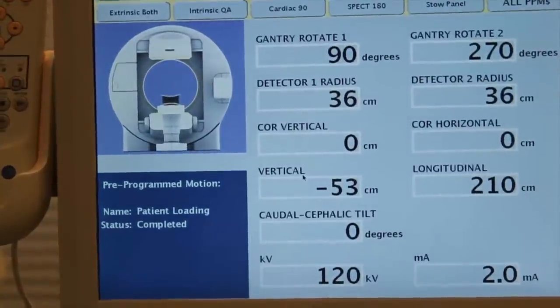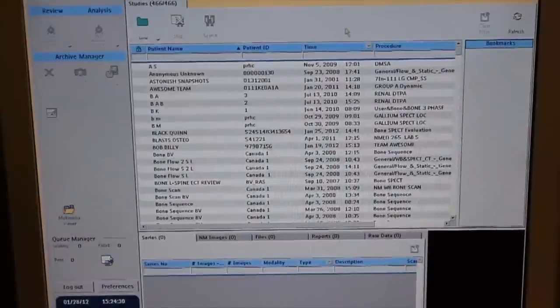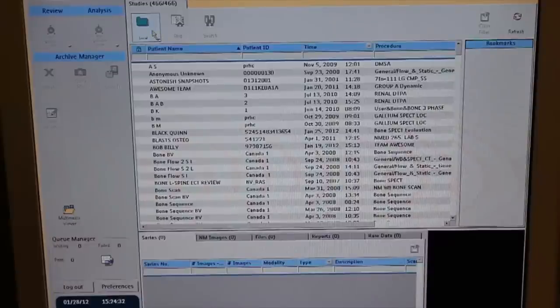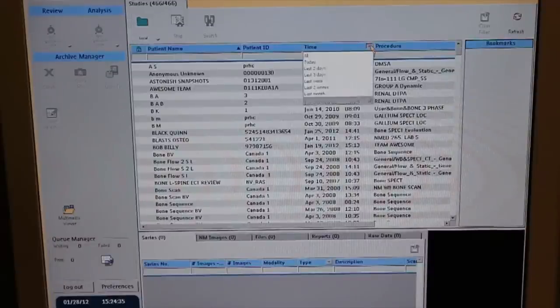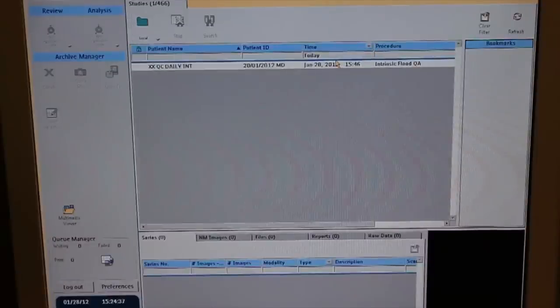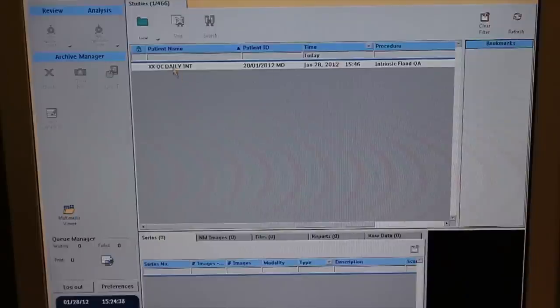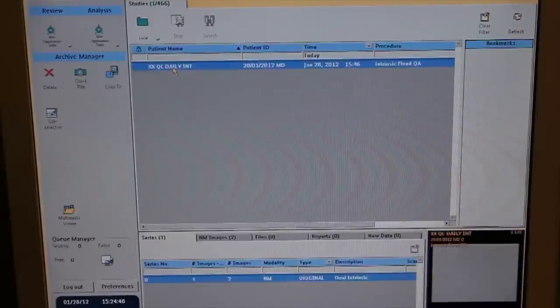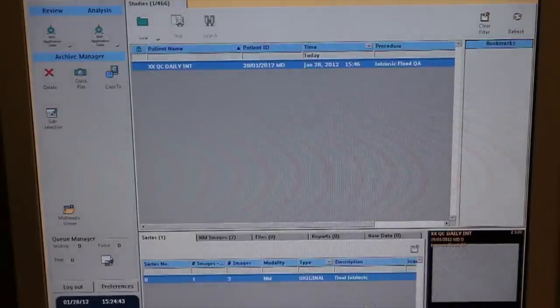Ensure that the motion is complete. At the EBW processing station, select your flood study. Ensure that both detector images are under the study.